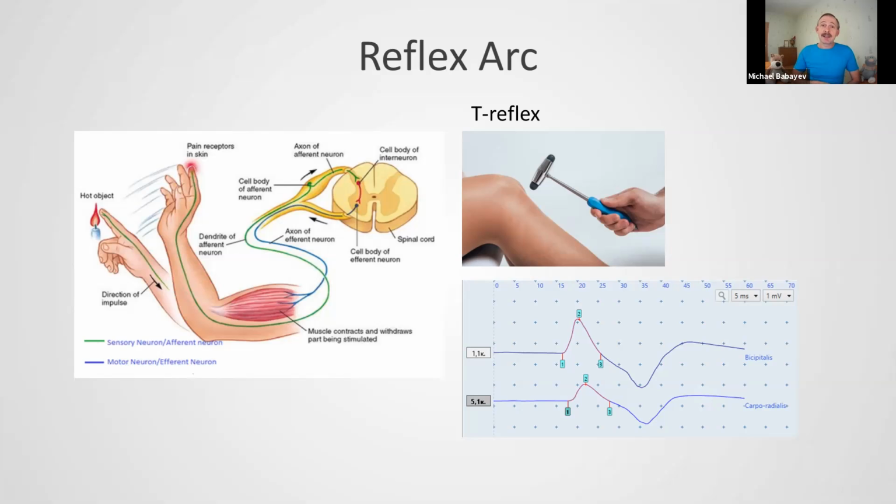So this reflex arc will save our health, and sometimes it saves our life because it is very fast, very quick. In the human body, we have a lot of different reflex arcs with 2 neurons, 3 neurons, many neurons. And if you have an EMG machine, it's possible to examine such reflexes. Maybe you know H reflex, blink reflex, R3 reflex, and some others.